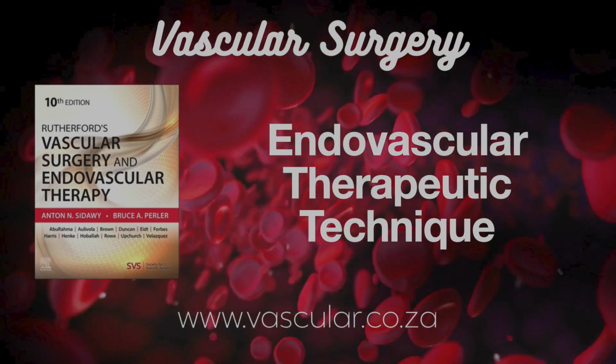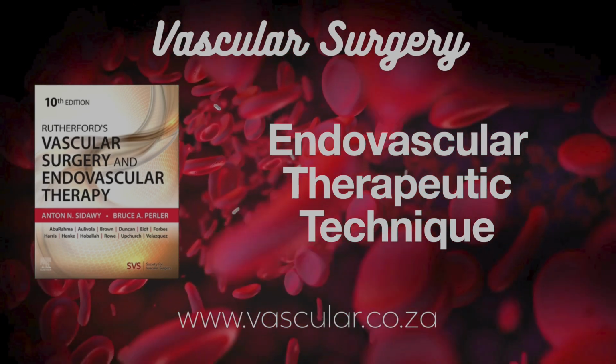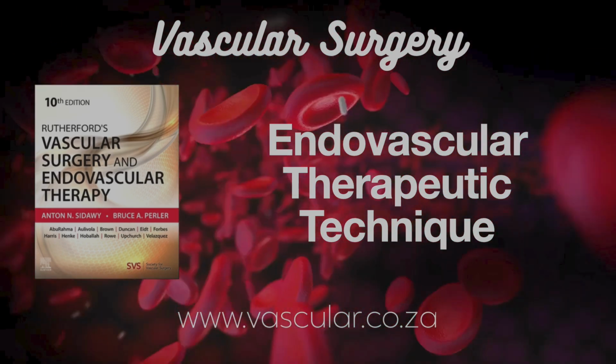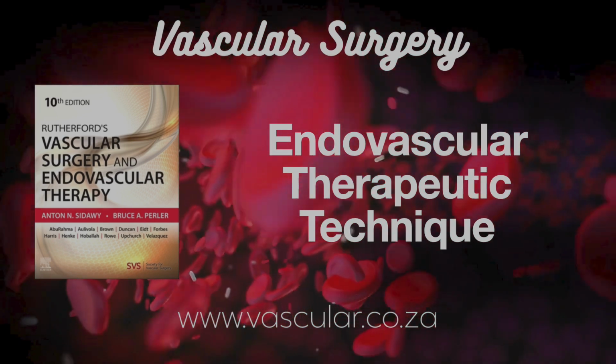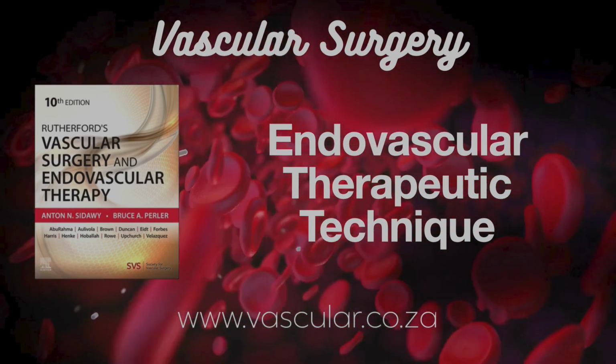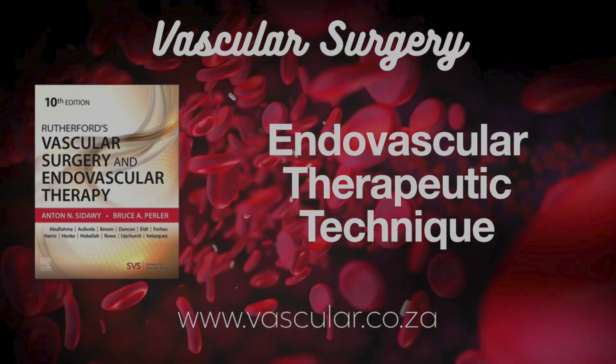And stent fracture, we touched on it. Why does it happen? More common in long stents, over 80 millimeters, overlaps, and areas with lots of bending, twisting, compression, like the popliteal artery. Stiffer stents might fracture more easily in the SFA. Can lead to restenosis, sometimes significant, sometimes not. There's a classification, type 0 to IV, based on severity. Choice of stent and location matter.